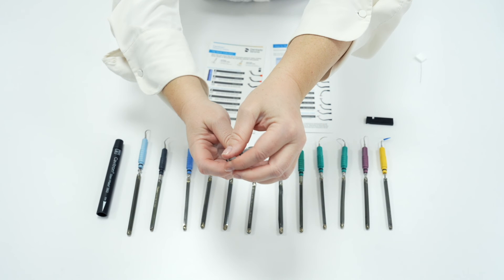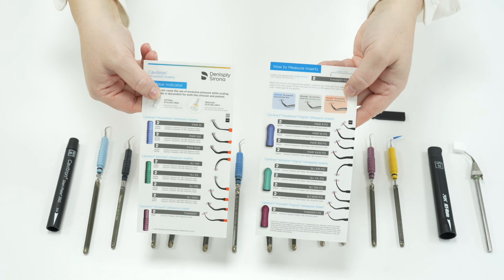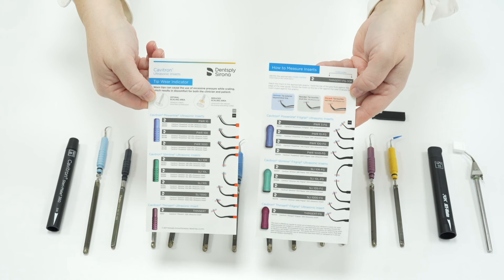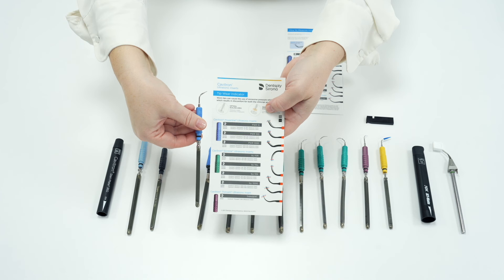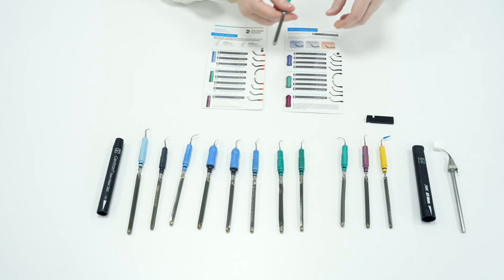Over time inserts will wear and possibly bend, and as mentioned this happens more quickly if you do not handle your inserts with care or fill the Steri-Mate or JetMate up with water. To help monitor inserts we use Cavitron insert guides which measure tip wear and tip shape. Simply take the card and identify which insert you want to measure by reading the stack — blue inserts will say FSI then a number, and green inserts will say SLI and a number, which will match up to the insert on the measurement card.